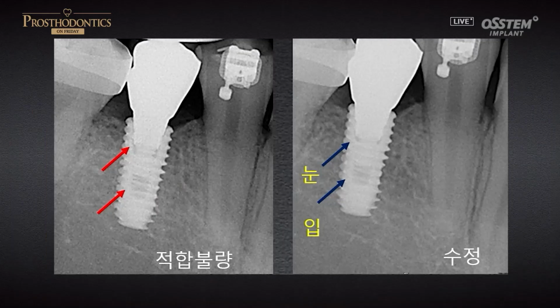Yes. There are two eyes and a mouth. There's the eye over there and the mouth. If it is wrongly connected, the form is weird. You can refer to this.